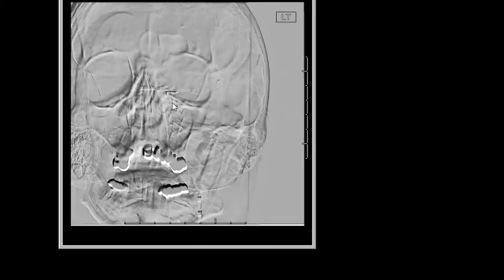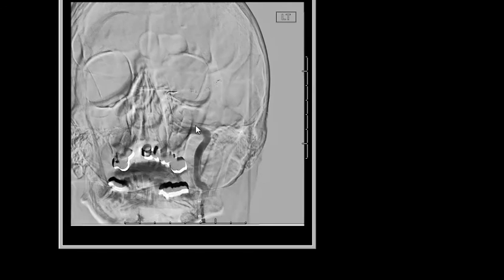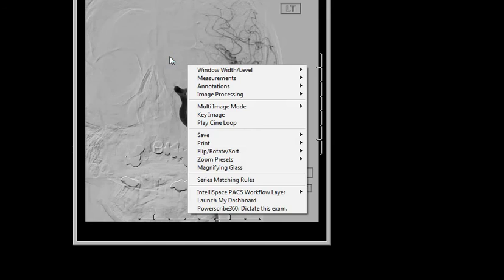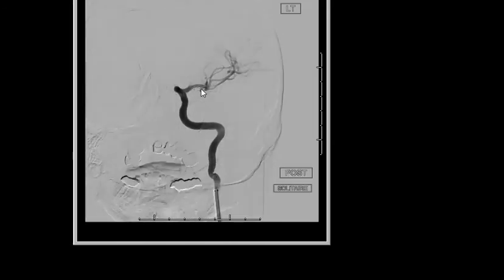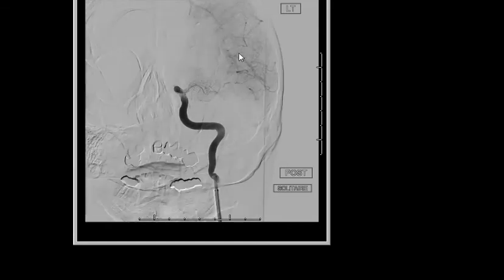The microcatheter was placed in the carotid terminus and extending to the MCA. They dragged the whole clot out, and eventually got most of the carotid terminus and the MCA back with some blood vessels perfusing the brain.